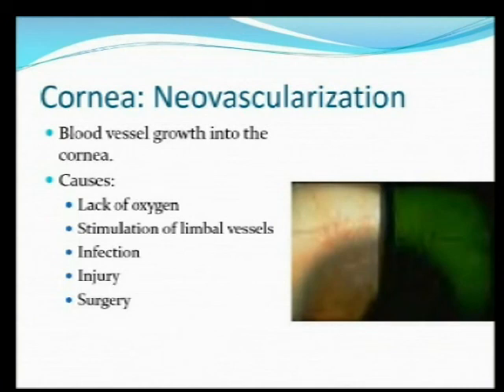You can use it to look at blood vessels, look for signs of neovascularization. And the filter that will help you here is you can still use diffuse, but instead of using that cobalt filter, the blue filter, we use a green filter, which is also known as the red-free filter. And the green filter blocks any red so that any blood vessel that was red now appears black.